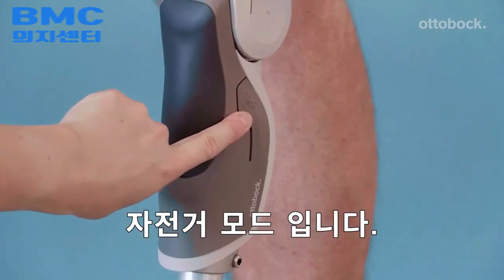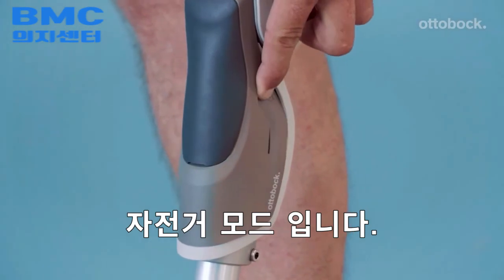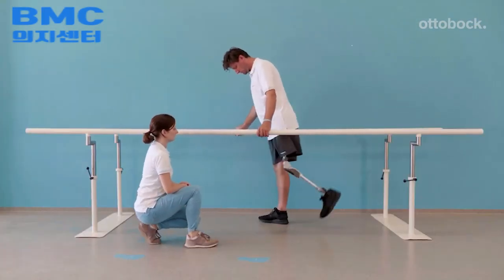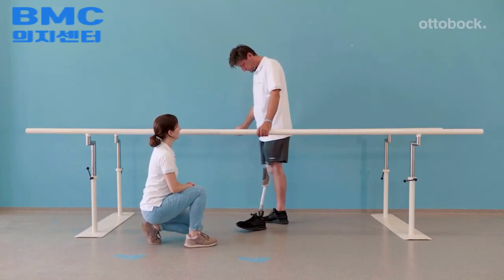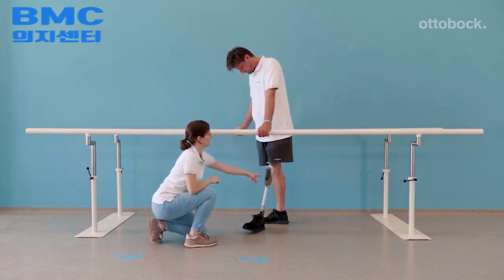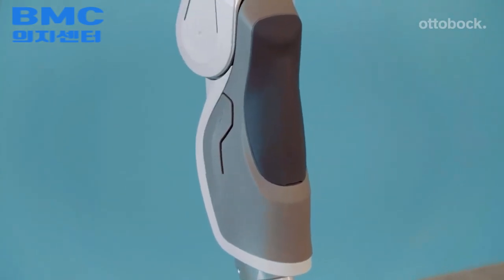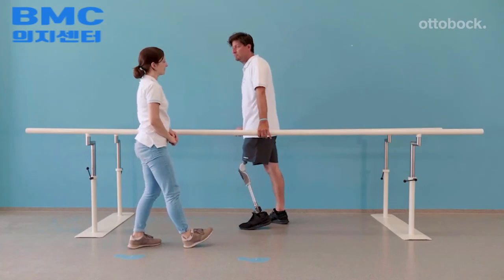To understand the free swing characteristics of the bicycle mode, try it first between the parallel bars. Activate bicycle mode only when on a bicycle, and remember to deactivate it before walking again. This mode is only for riding a bicycle.